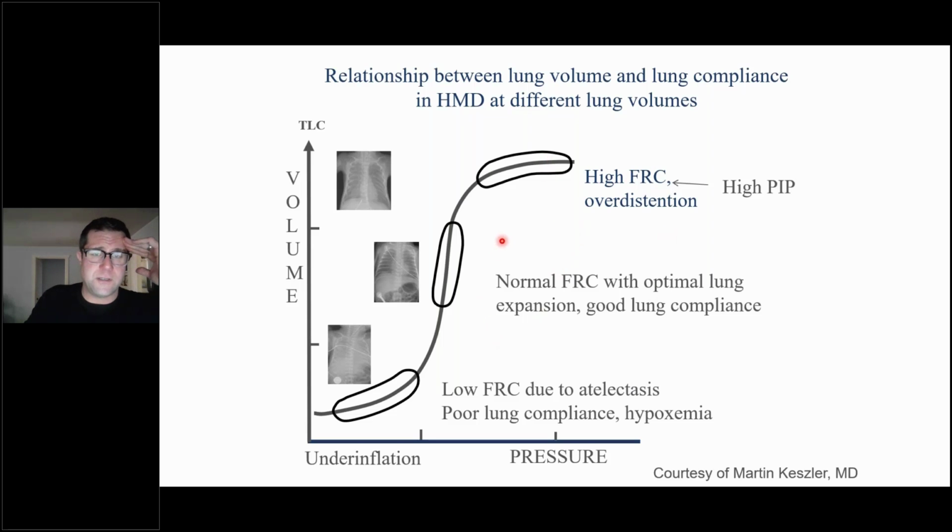to be able to make assessments on pulmonary compliance in these small patients, based on the fact that the pressures are measured back at the ventilator. We're not doing a slow inspiratory flow to achieve this compliance measurement. And so they get small ET tubes. And so it's tough to look at compliance curves in these patients.